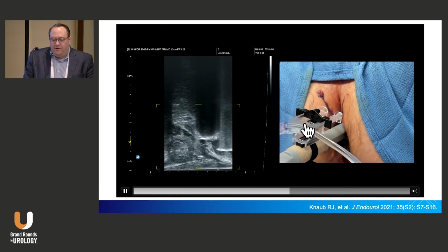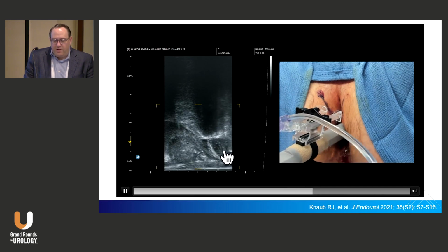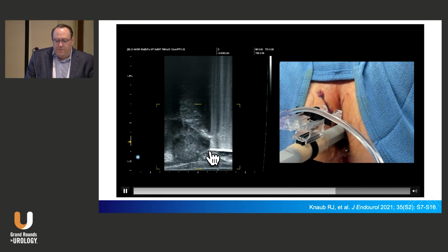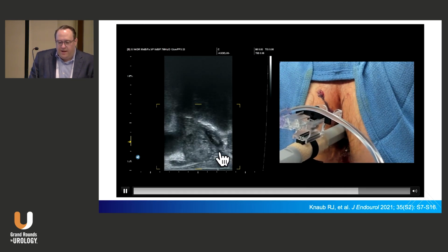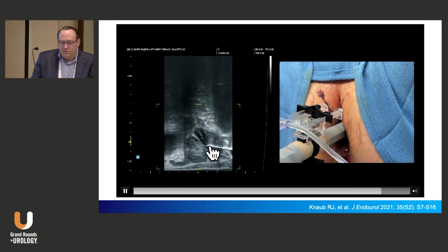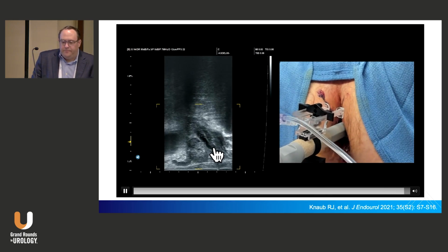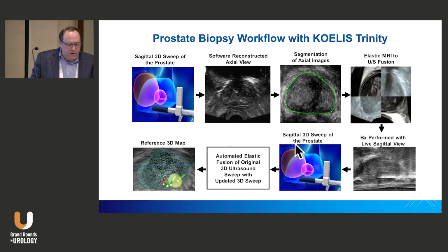And then I'll pass my needle under ultrasound guidance and infiltrate that triangular column, the soft tissue. You'll see the needle punctures right into the levator ani muscle complex and just fills it with the lidocaine solution. Then I'm going to puncture underneath the endopelvic fascia here and inject more solution to bathe the prostate itself. So maybe another 20, 30 mils on one side, another 20, 30 mils on the other side. And before long, I've basically consumed 150 to 200 mils of the solution.